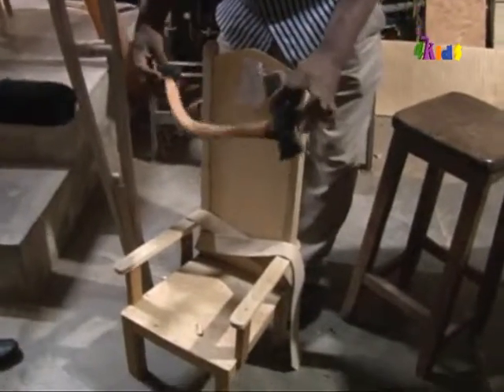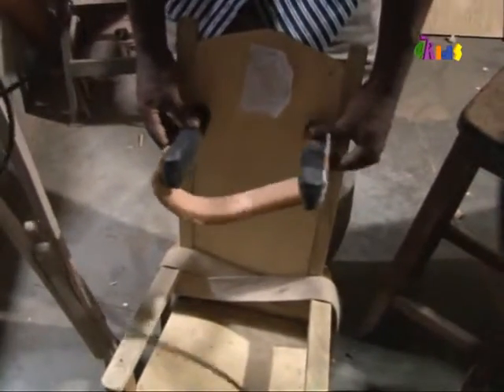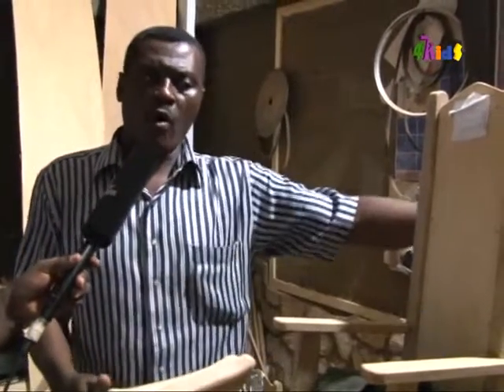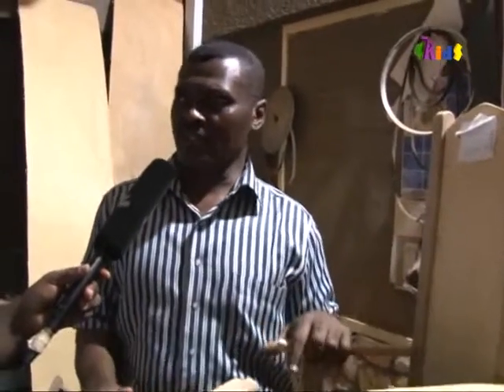A special chair made for children suffering from cerebral palsy is manufactured by carpenters at the workshop. This chair enables them to learn how to sit, while the mother is also trying to wash their things, and it will be there for maybe below 2 or 3 months. Then you see them sitting of their own, and finally you see them also trying to hold walls, chairs, and walk around in the house.